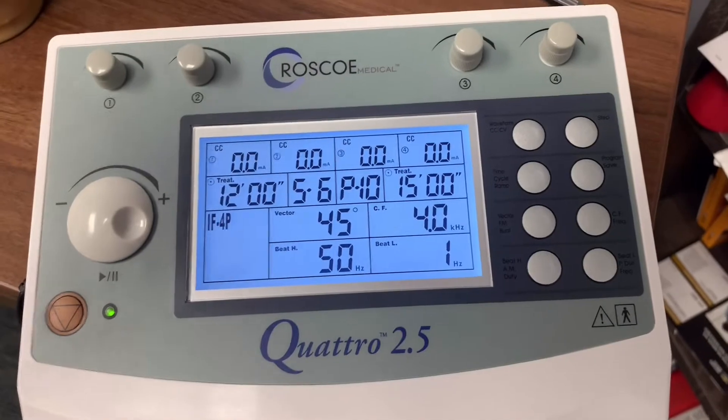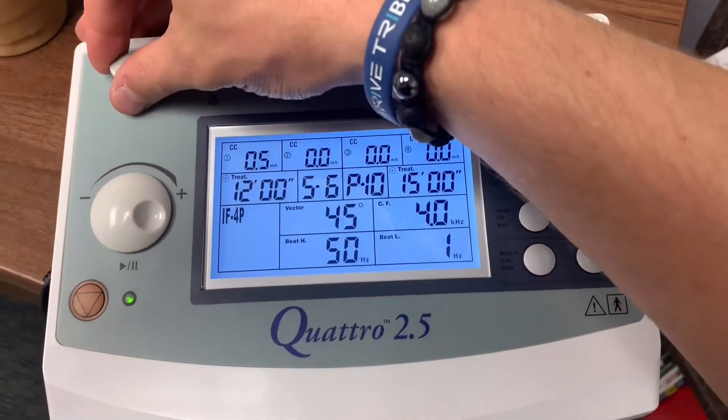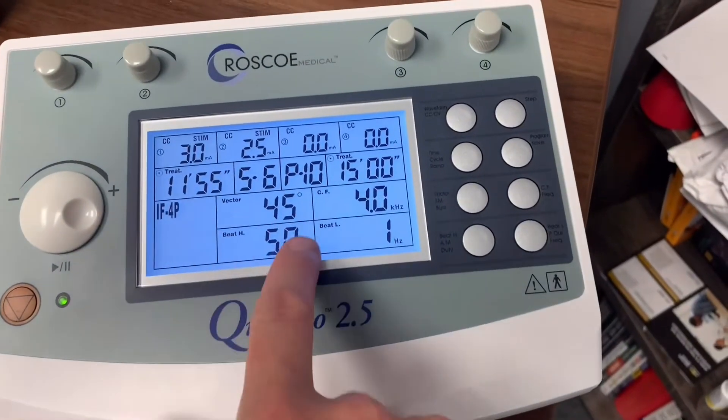All right everybody, so I wanted to show you guys how to also set channels 3 and 4. So what we're going to do is start the intensity on channels 1 and 2. You can see our output here.